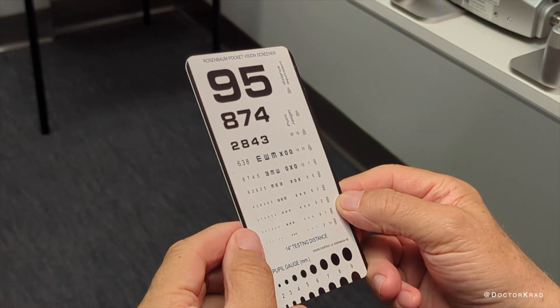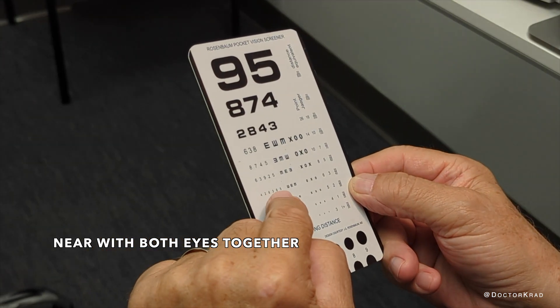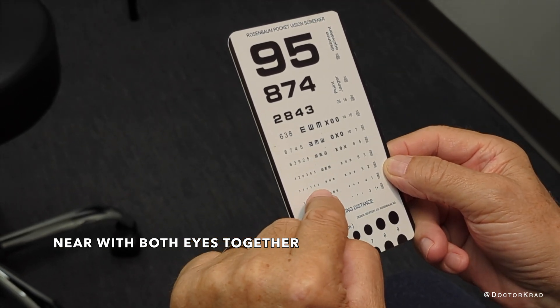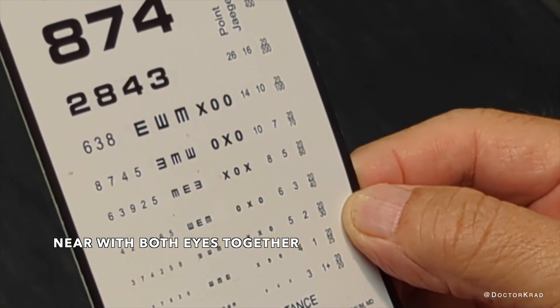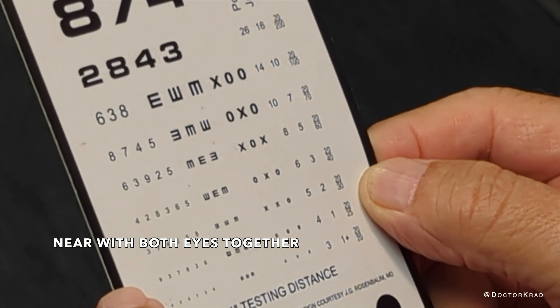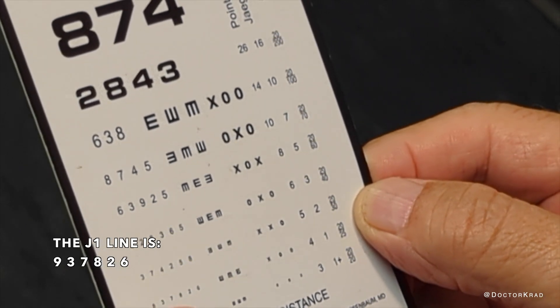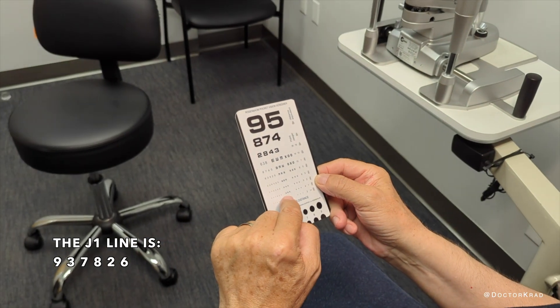With both eyes: 1-4-2-8-3-6-5. 3-7-4-2-5-8-6. In the middle, seven. 9-3-7-8-2-6. That's pretty good.